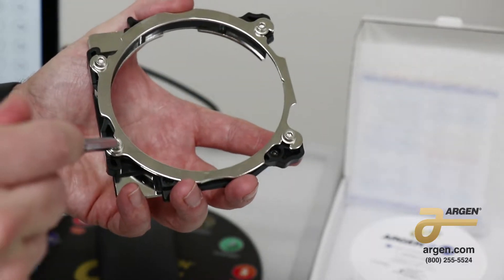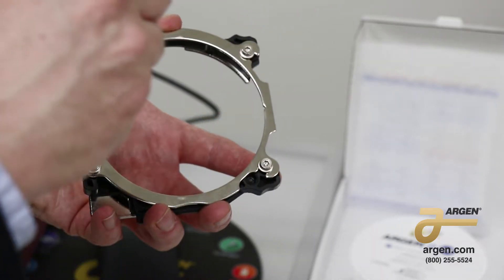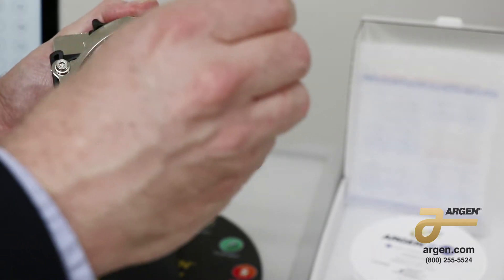First of all, with a torque driver, you're going to loosen all four of the screws. You will not be removing the screws, you're just loosening them.